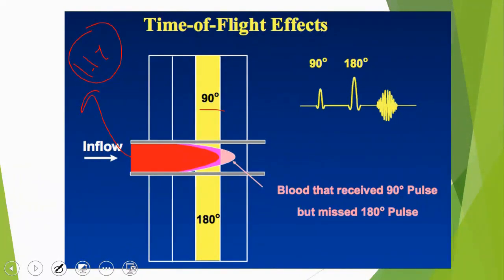In another segment, not the same one, but the blood has moved to a new place, right? Let's pay attention, everyone. I worked on this slice, so the magnetization of this segment has all dropped. It has been flipped and has dropped into the X and Y plane.